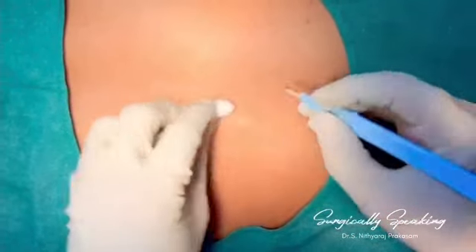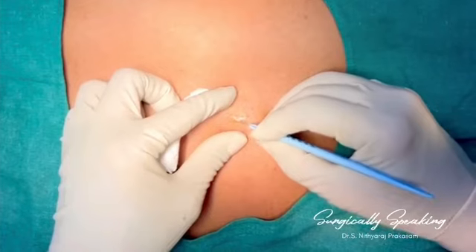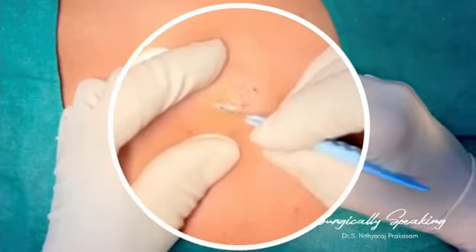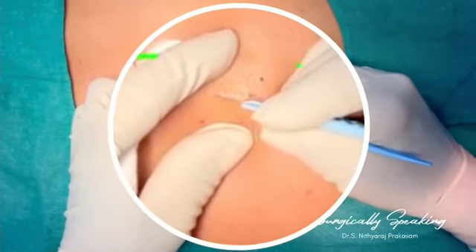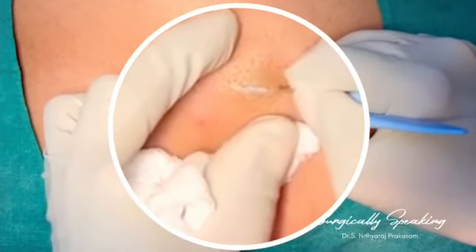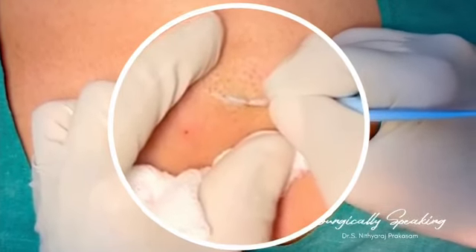Carefully deepen the incision and take care not to puncture the capsule. That grayish tissue which is coming into view is the surface of the capsule.